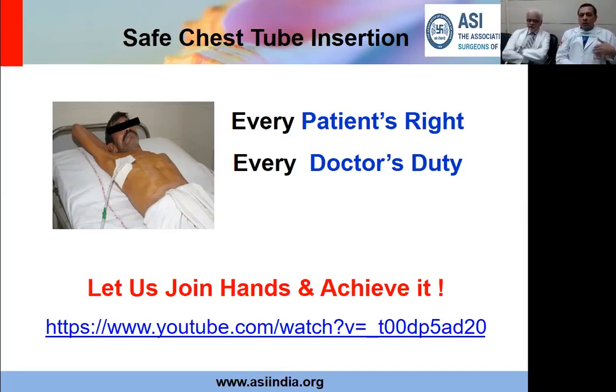See, there is no upper limit for keeping the chest tube. It also depends on the reason why. So if you are needing a chest tube to be kept beyond a few weeks, there has to be a reason. So what would be the reason? You are probably having air leaking out. If air is leaking out, then it's an indication for intervention.